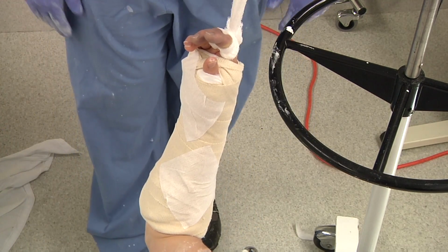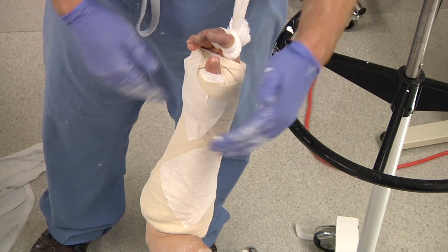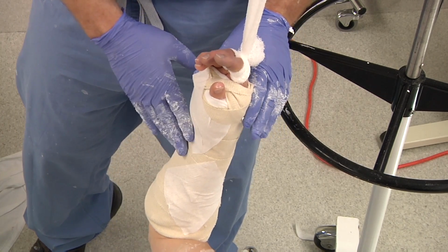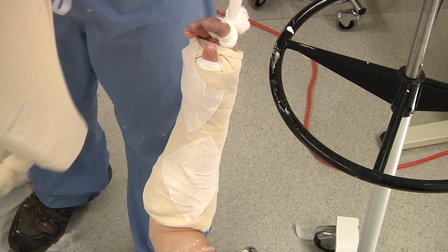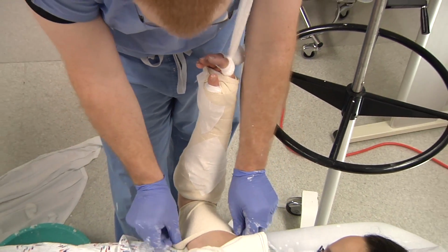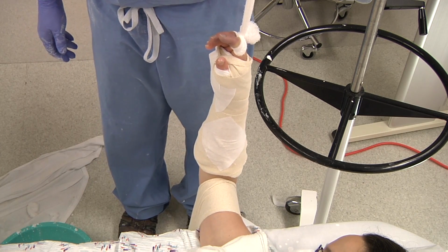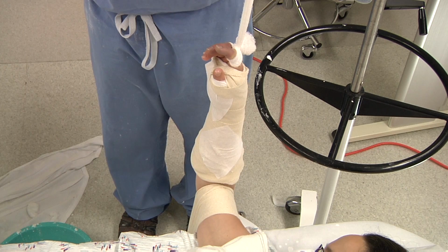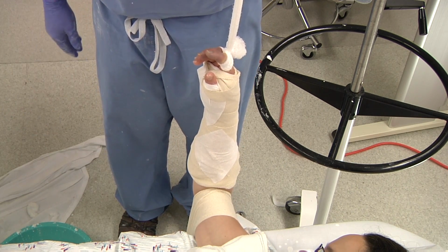Once your plaster is hard, it's very easy, or at any point, to bring your C-arm in and take radiographs in the appropriate planes. If we did want some added traction before applying this, it's very simple to make a little traction device. So we can have a link to that or show it, and then broadly apply it to the arm and allow the patient to hang in some traction for a period of time. This can easily then be cut off or removed once the plaster is hard or at any time.